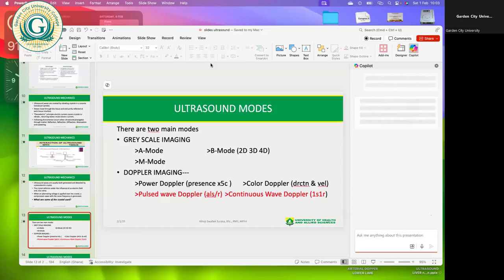So most of the time you ask, oh, why is this not coming in colored? Why is this not coming in this? That is the principle underlining the B mode. So it cannot actually come in colored as you want it to. There are other equipments that show it better. And that is what we are moving on to.